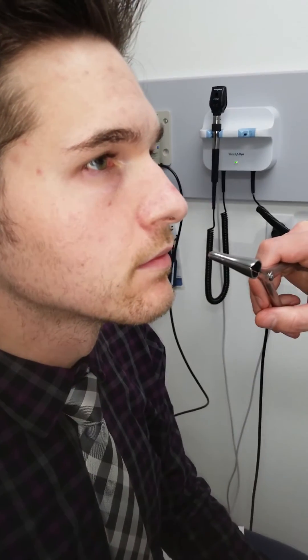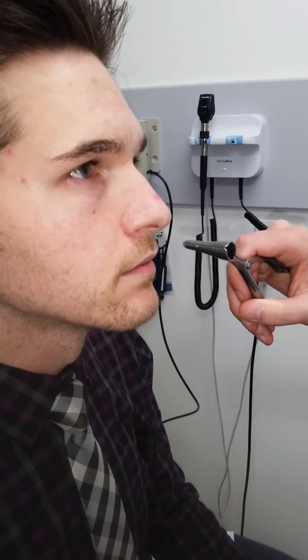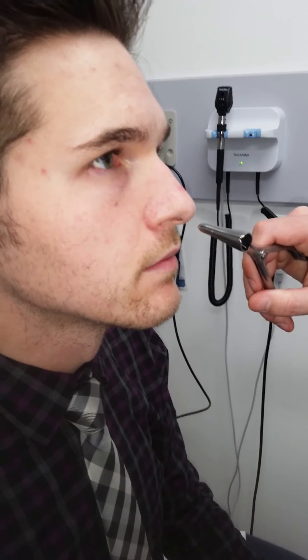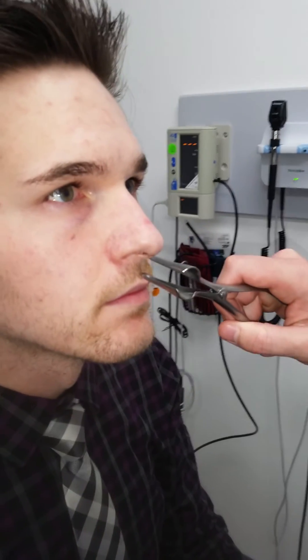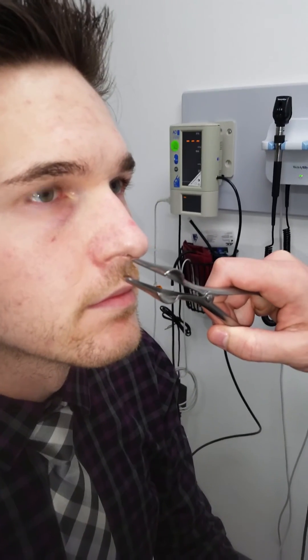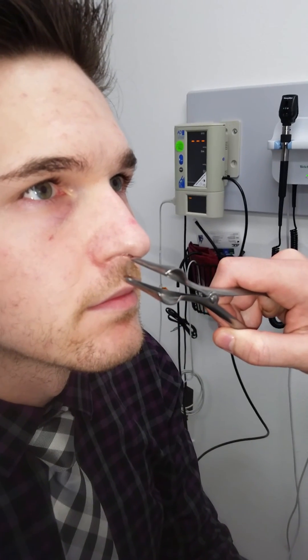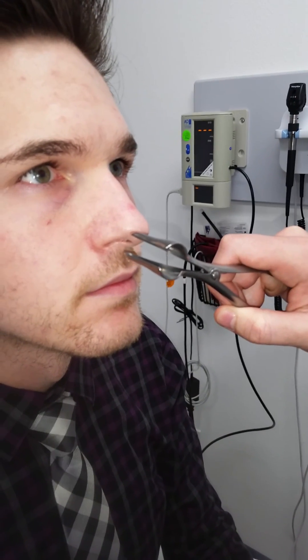If available, you can use the Thudichum speculum, which is inserted inside the nares and then squeezed open by the handle to broaden the structures and allow examination of the nares.